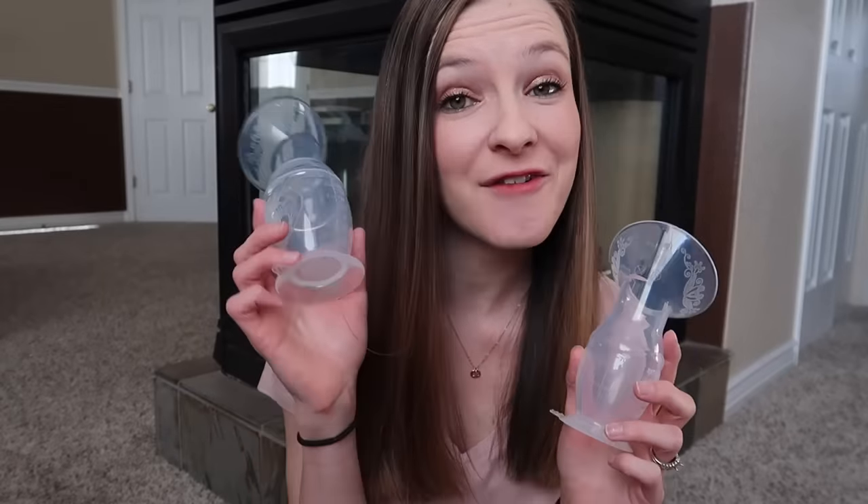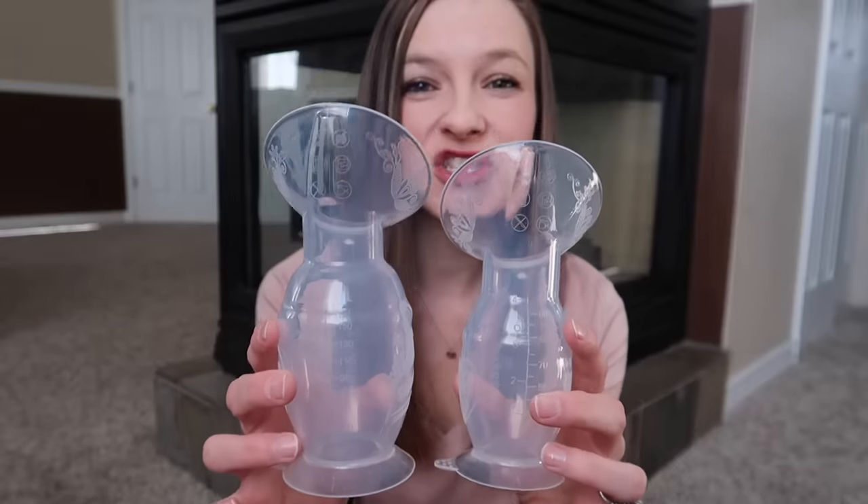There is a four ounce version of the Haakaa pump and there is also a five ounce version, which is just slightly bigger for that extra ounce. When you are done extracting the milk, it does come with a little cap that you can just pop right on there, and you can make sure that nothing is going to seep out of it if you do have to set it down somewhere while you're finishing up breastfeeding.